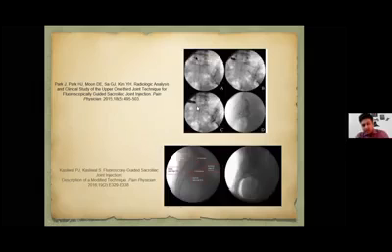Probably because in the superior portion the ilium is a little medial, but the sacrum is a little like this, so you have to go quite from a medial to a lateral position. So that's why they have started from the L5-S1 disc.